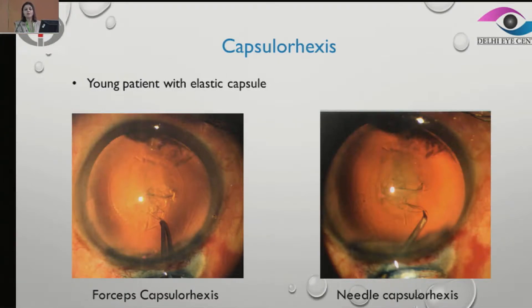If that happens — if we begin with a cystitome and we feel that the rexis is running away — you can use forceps and pull the rexis back. It gives us better control.